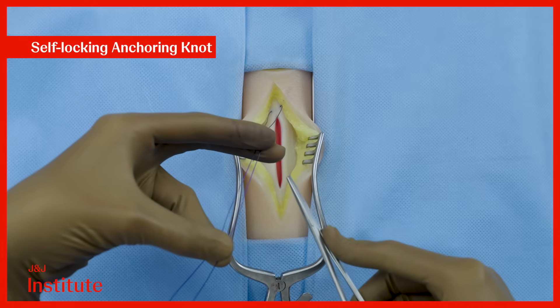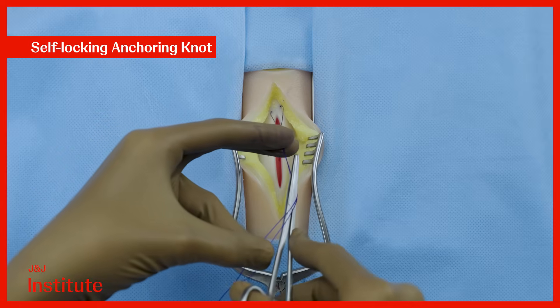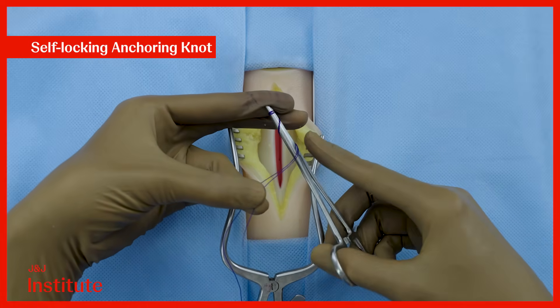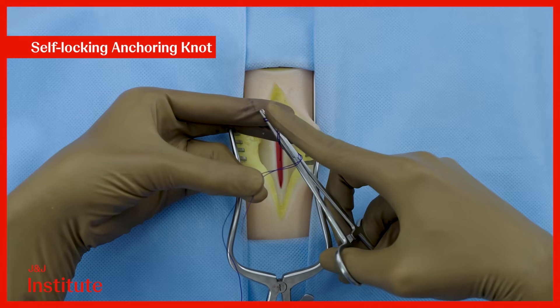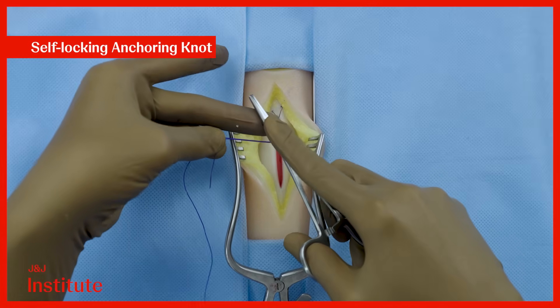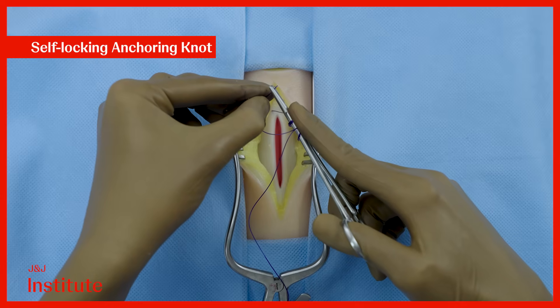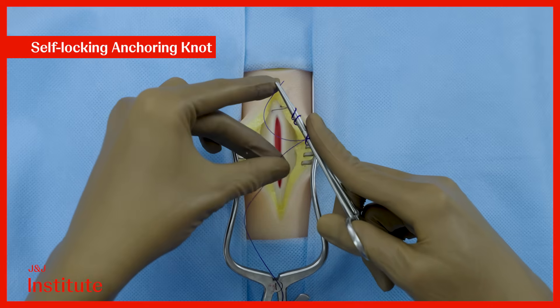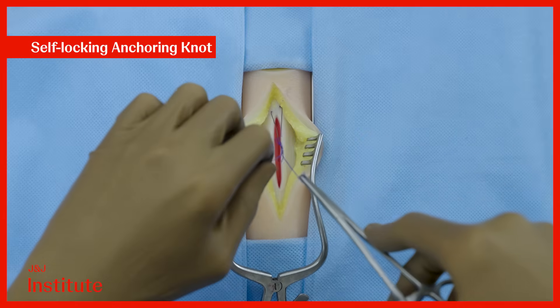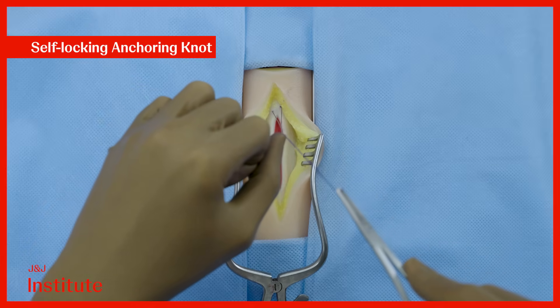Introduce the needle driver from underneath these two parts of the thread, point it slightly downwards and rotate the needle driver 3 times to create 3 loops. Use the right index finger to bring the 3 loops together and hold them in place. Take the left hand and feed the short end of the suture to the end of the needle driver and pull it across the 3 loops. Pull upon the suture to tighten the assembly.